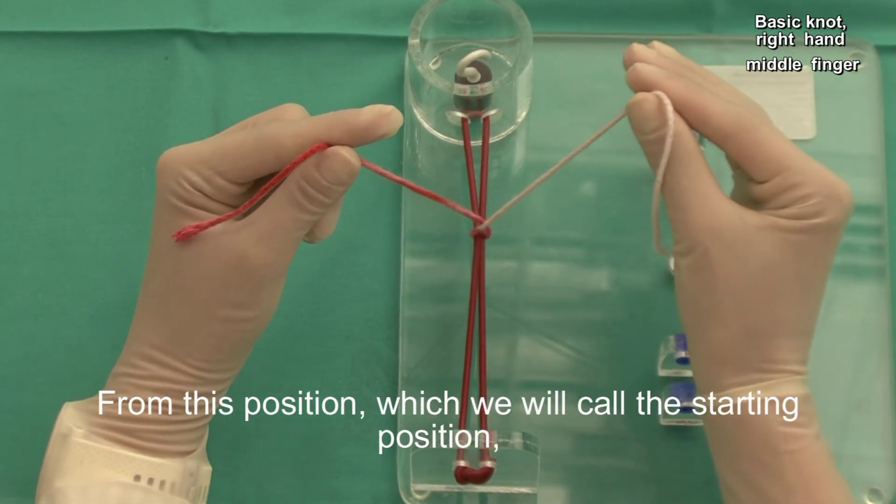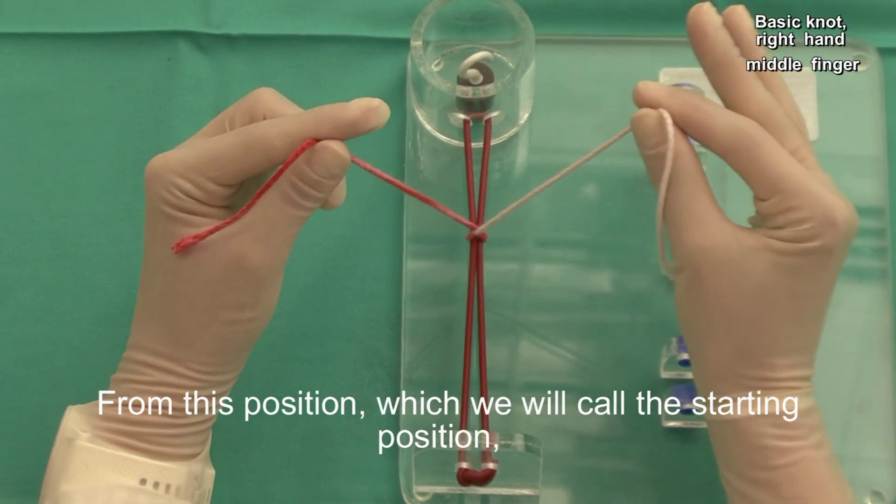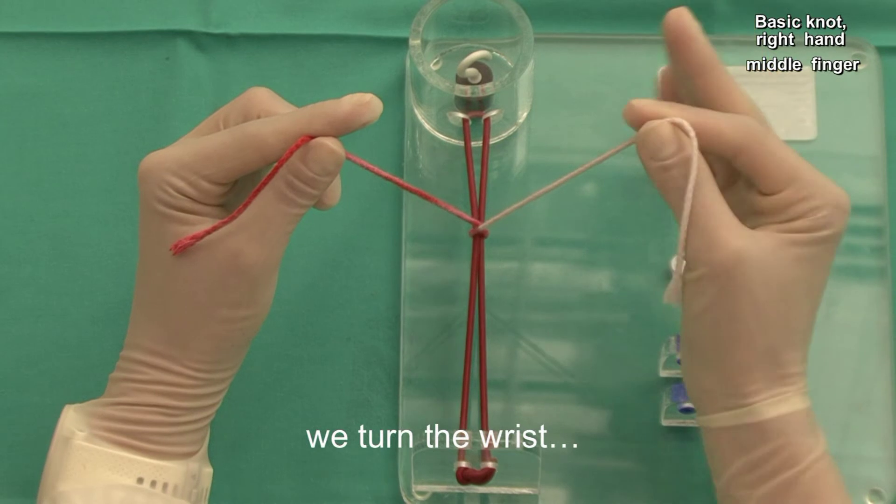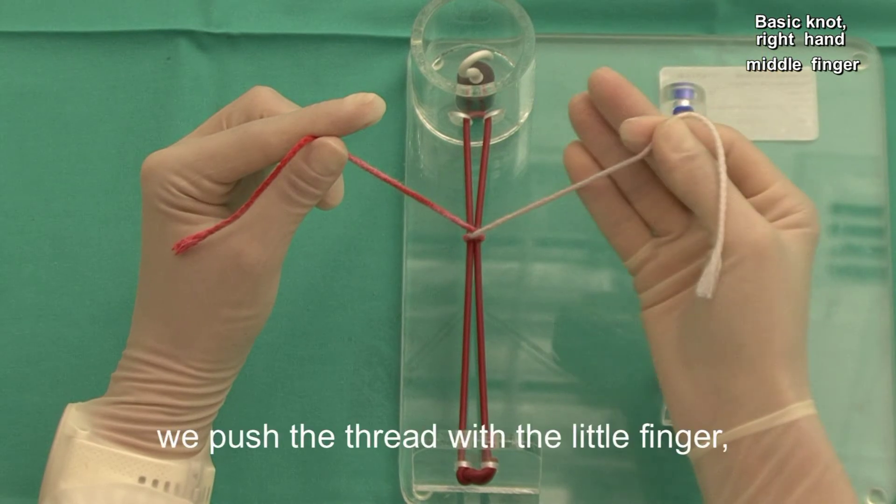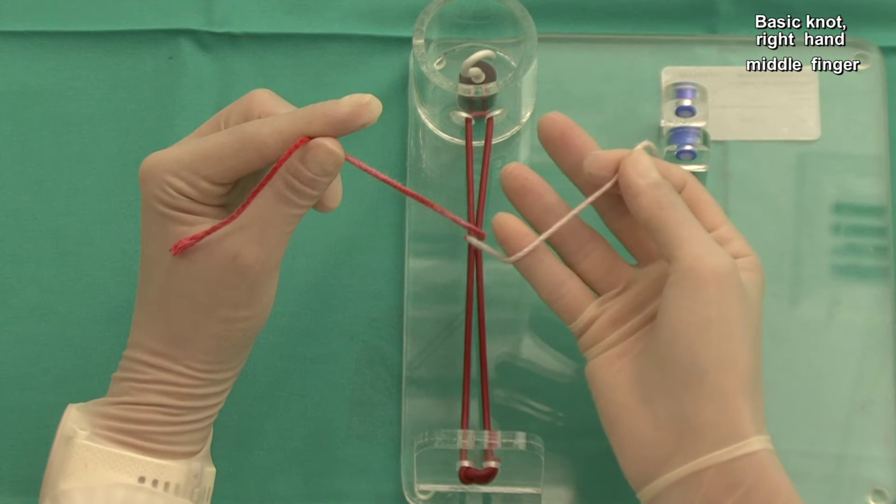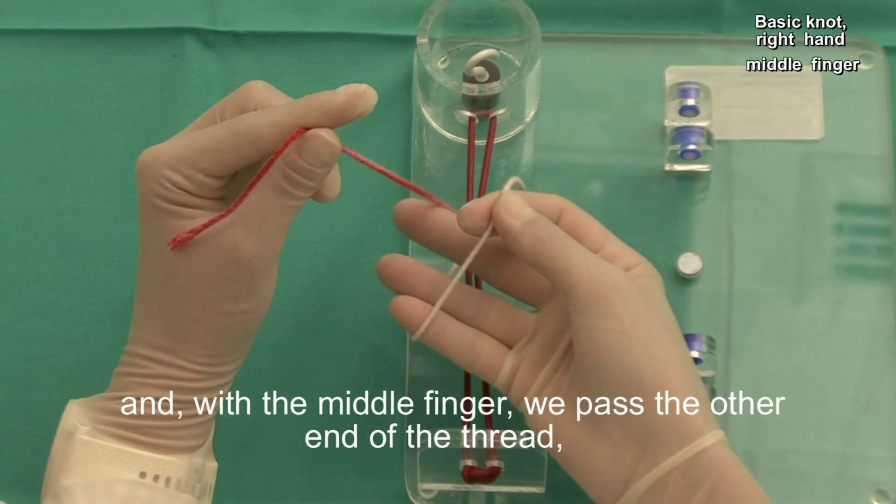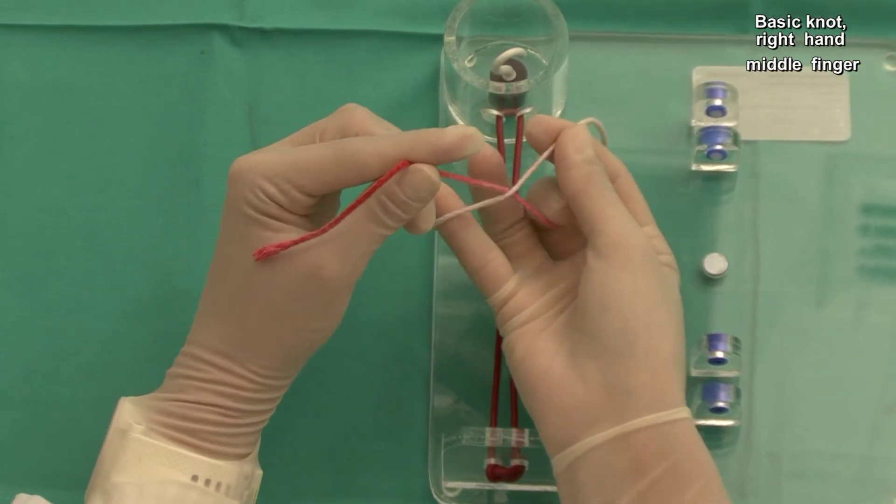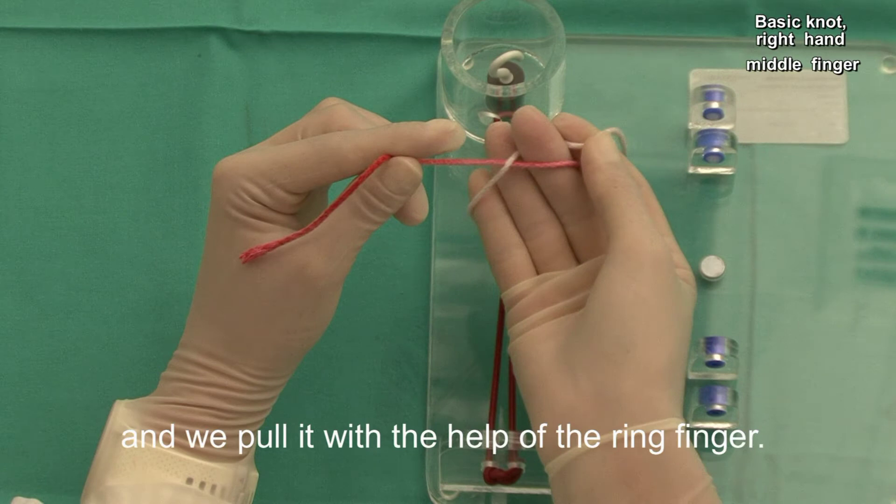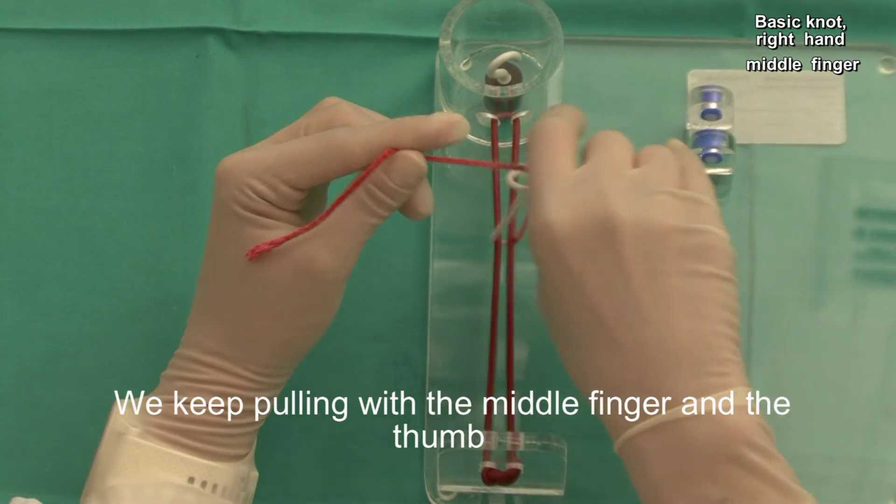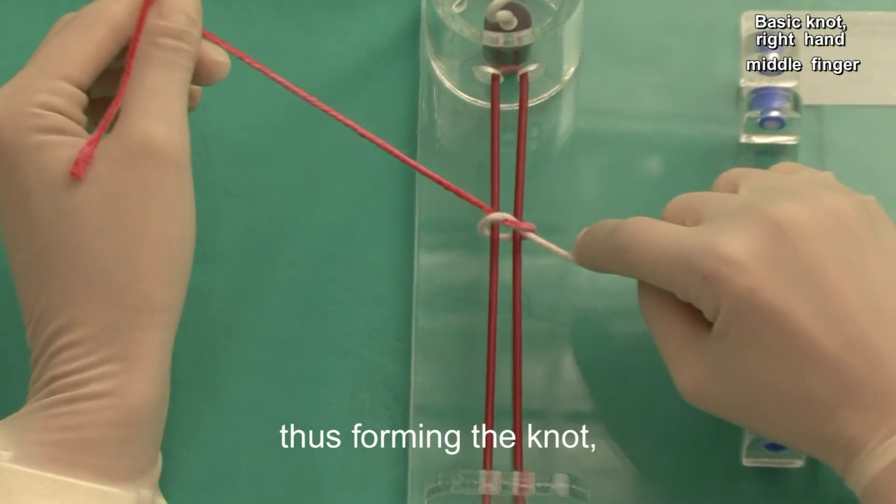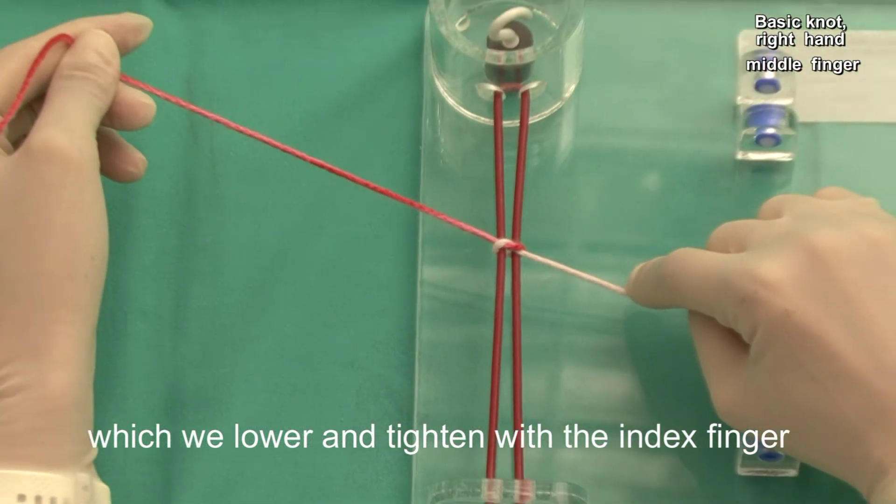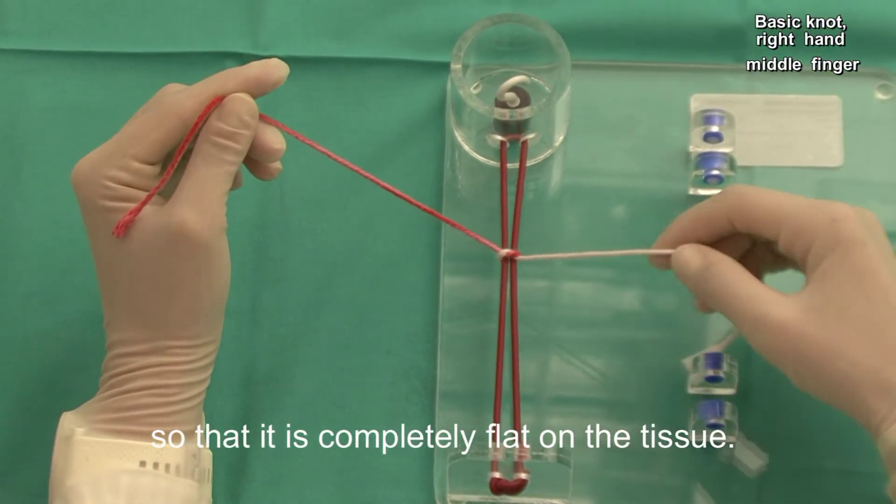From this position, which we will call the starting position, we take the end of the thread between the index finger and the thumb, we turn the wrist, we push the thread with the little finger and, with the middle finger, we pass the other end of the thread and we pull it. We keep pulling with the middle finger and the thumb, thus forming the knot, which we lower and tighten with the index finger so that it's completely flat on the tissue.